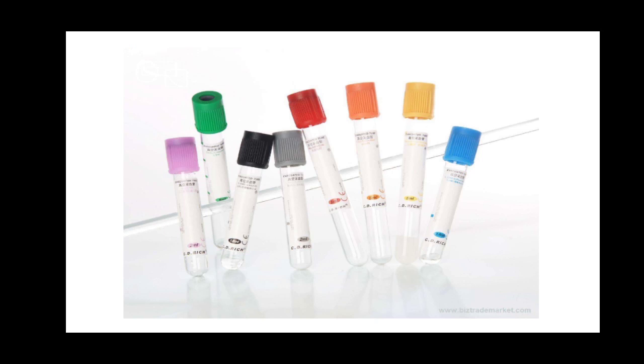And there are the vacutainers or sample containers, whose tube colors indicate the additives present in them. Here we can see lavender, red, yellow, blue, black, grey and green, the colors of the tubes or containers.